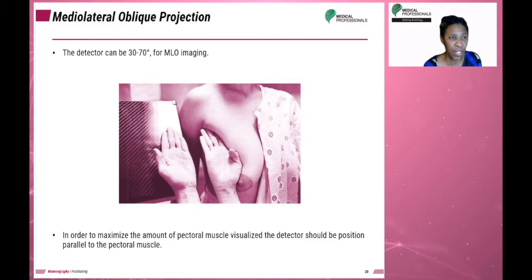So that can range anywhere from 30 through 70. Typically for taller patients, it's approaching the higher numbers, and for male patients in particular, it may be at the 70. For average patients, you may be in the 50s to 60s. Sometimes with a patient who is shorter, heavier set, I may use a low angulation just to have control of the anterior breast tissue when you're compressing, and also to get an open fold.